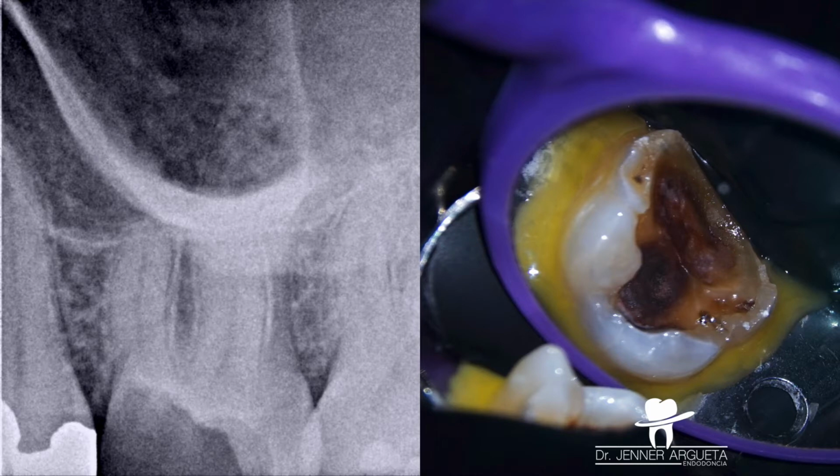The patient asked us to do our best to save the tooth. And the first thing that we have to do is to establish a diagnosis. The tooth was not responding to the sensibility tests. We might see that the periodontal tissues are in a normal condition, and we decided to isolate the tooth and to remove all the caries that is affecting this tooth. It is very affected and we need to remove that caries to have a better understanding of the stage of the tooth.